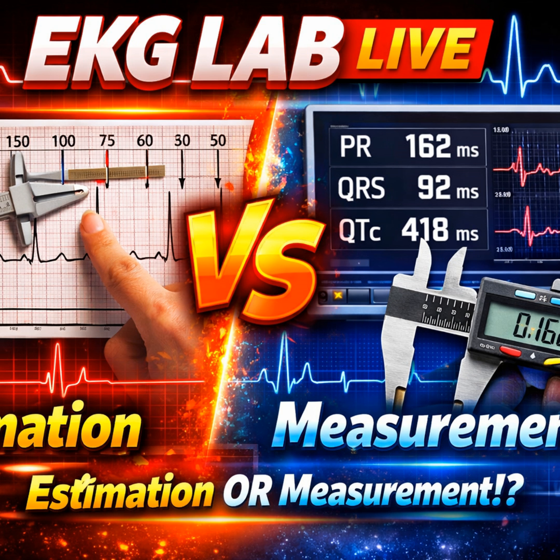A block is a measurement. Take Mobitz type 1 or Wenckebach. The definition is a progressive prolongation of the PR interval until a beat is dropped. That prolongation might only be 0.04 seconds, one single small box, per beat. You cannot feel a PR interval lengthening by 40 milliseconds. You have to measure it.